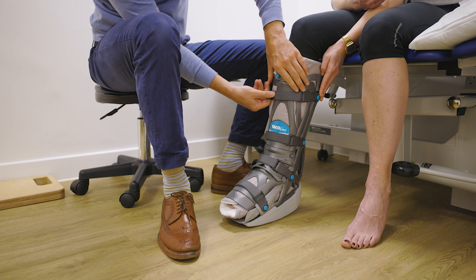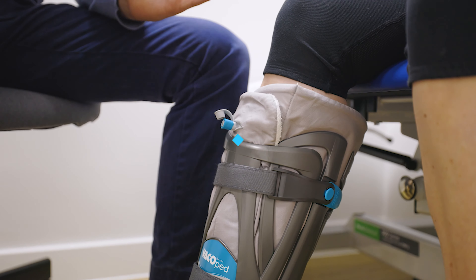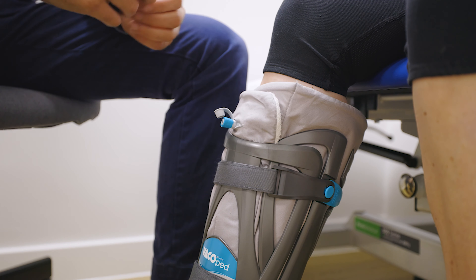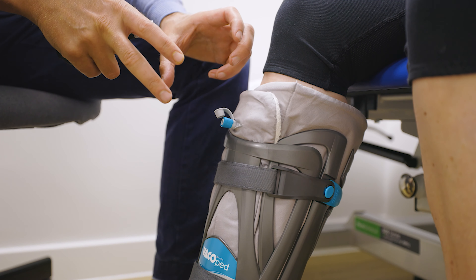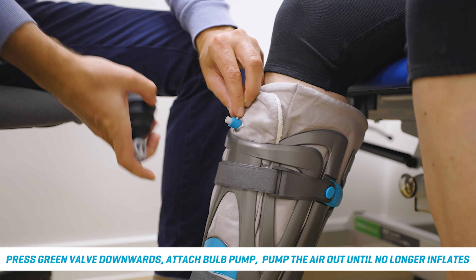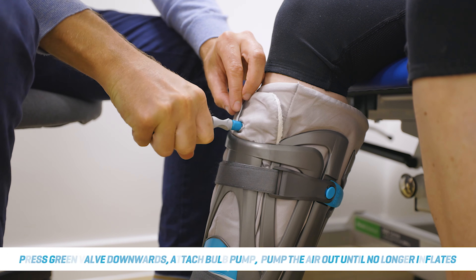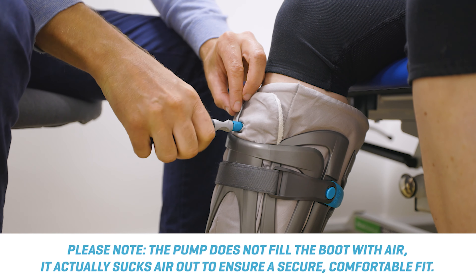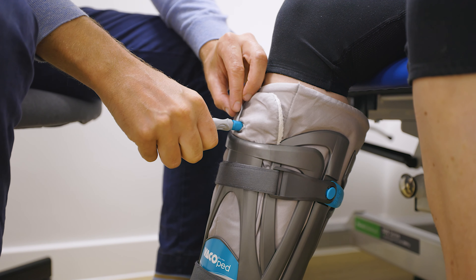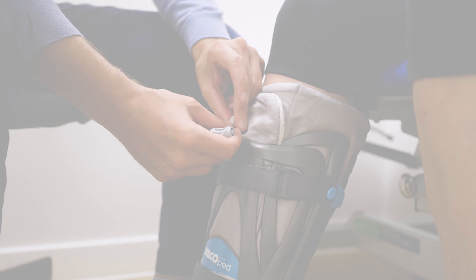These are really comfortable, so that should be a nice snug fit for your patient. Now we've got the boot on, but we see lots of patients that forget to do this last bit. It's so important, particularly in the early phases, because we need to pump up the VACO-PED to ensure that you maintain the correct position for your ankle. With the valve, push it backwards, get the pump, push the pump on and then pump up. Then bring the valve off, pop the lid back on, and you're good to go.